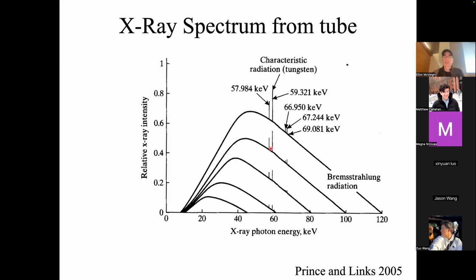You get a spike, but it's a small fraction of the total number of photons coming out. So if I say, I need some more high energy X-rays to image this person, I click my voltage on my tube up to 120, and voila, I get a lot more X-rays at 100, right? So I have a lot more high energy X-rays to image that patient.